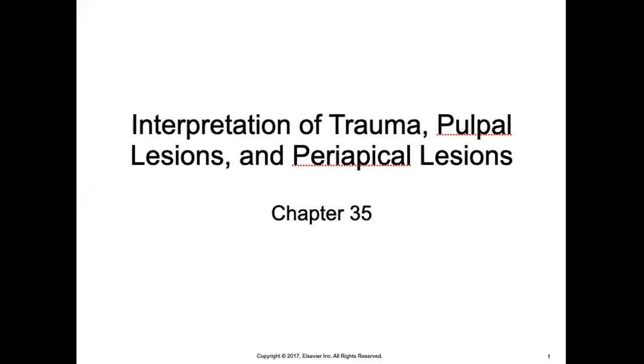Okay, so today's lecture, which is our last or final lecture of DAN 160, is chapter 35, which starts on page 426 of your dental radiography textbook. This deals with the interpretation of trauma, pulpal lesions, and periapical lesions.